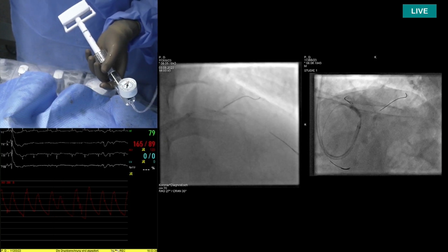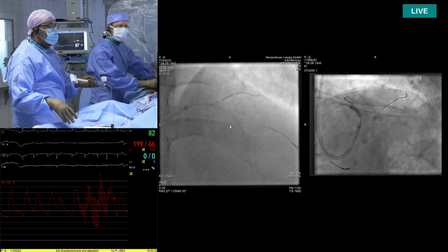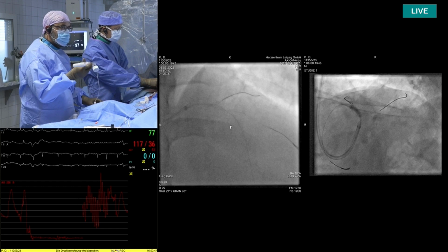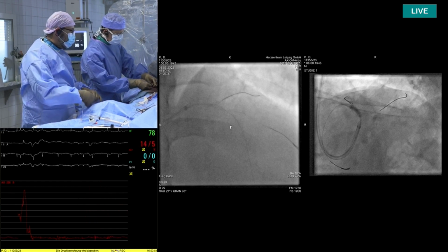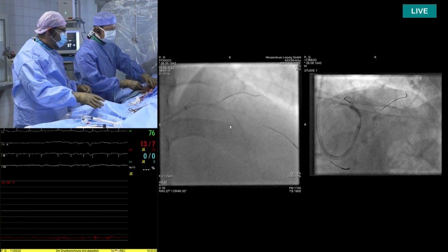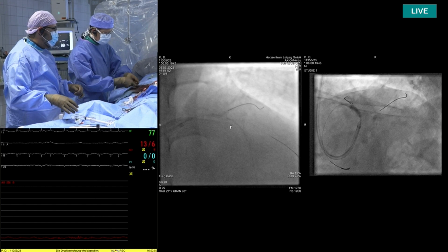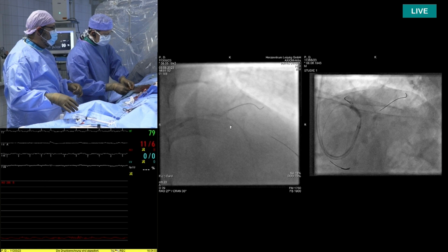Okay. So let's try this now. Let's see whether the catheter crosses. Agree? Yeah. We can do it. Patient is fine. Do we want to see an angio? We can, yes. Not really. Not sure whether we need it, but we can do it. We don't need it. Yeah. The ECG is okay, blood pressure is okay, no complaints, we can work.